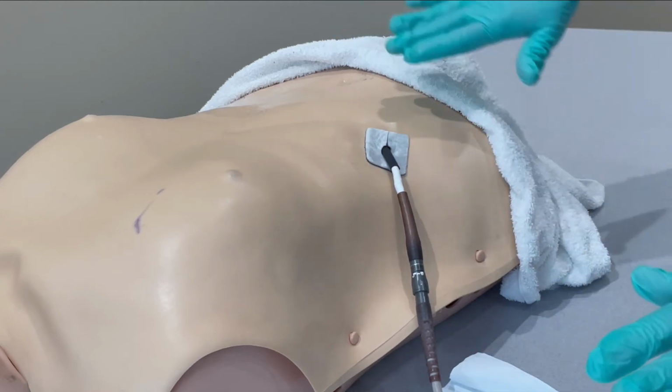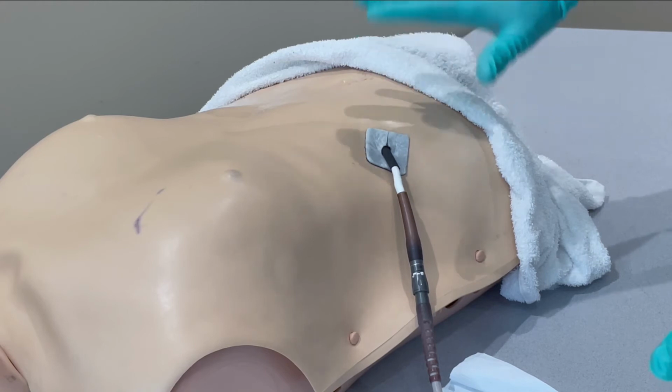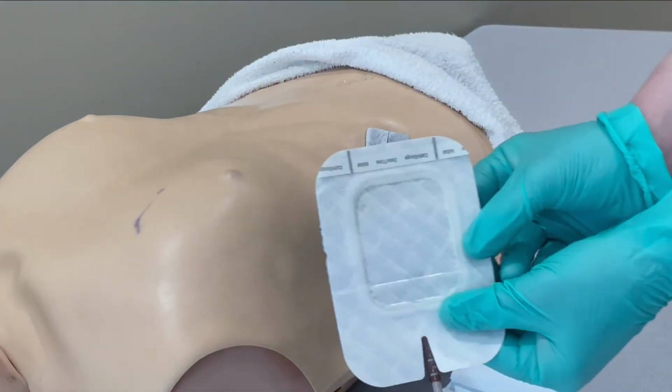Now we have our skin prep on, our silver disc is moist and wet and silver side down, and our chlorhexidine is dry. So now we can get our dressing ready.